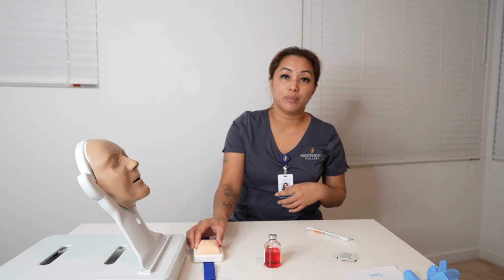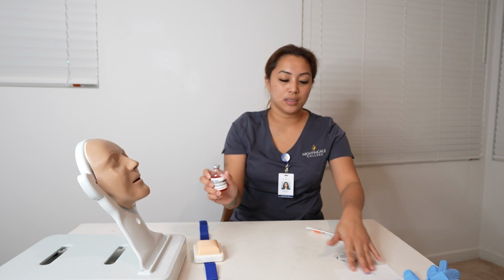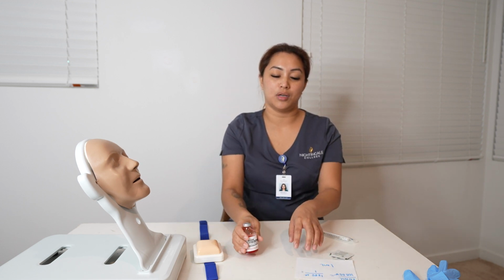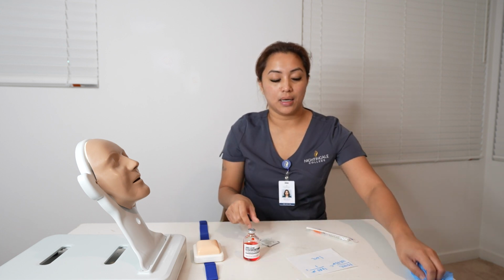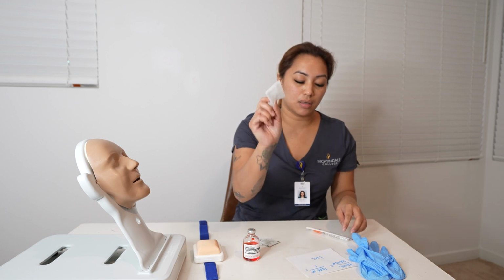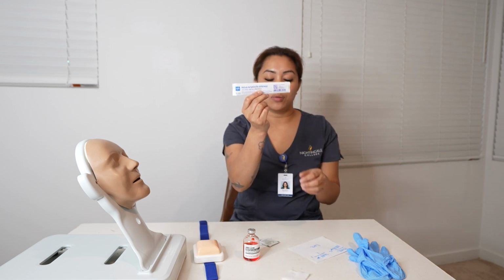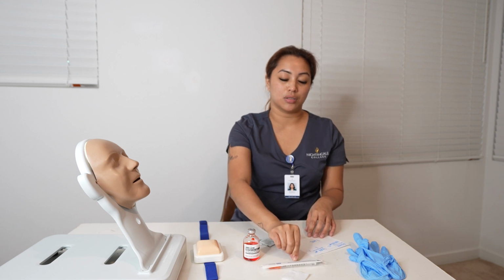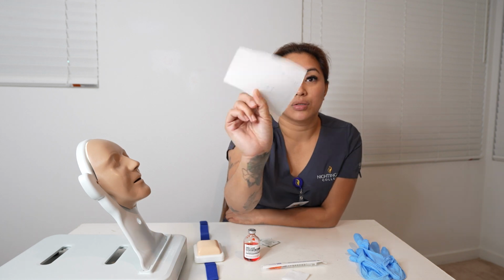Miss Smith, her belly, heparin, 10,000 units, 10 ml that is available. Alcohol pads, gloves, gauze, and my 1 ml equals 100 units syringe, and my dosage calculation. There's nothing on the back.